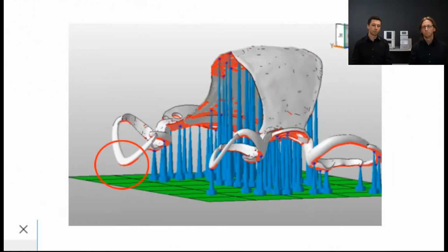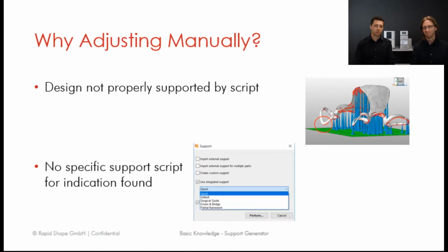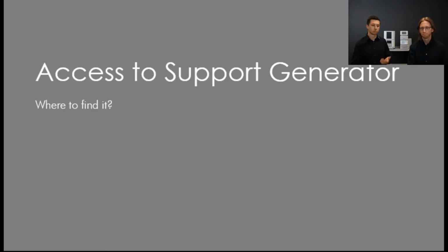If we have a closer look at this partial framework, you can see it seems to be quite okay in most of the areas, but there's one area which is not supported well. So it's an island. We will print into the nothing. Same thing can happen if you can't find a specific support script for the indication you're using. Maybe it's something totally free, maybe it's a special indication and there's no support script for it. In this case, you also will have to adjust, pretty sure we'll have to adjust the integrated supports manually. So, and in order to do this, you first, of course, will have to know how to get there. So, Robert, how can I find this?